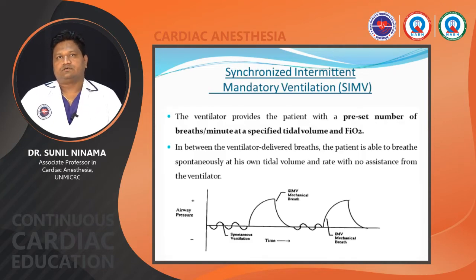This is the mode called synchronized intermittent mandatory ventilation. The ventilator provides the patient with the preset number of breaths per minute, specified tidal volume and FiO2. So you have to set the tidal volume, respiratory rate and FiO2. As the name suggests, synchronized intermittent mandatory ventilation.